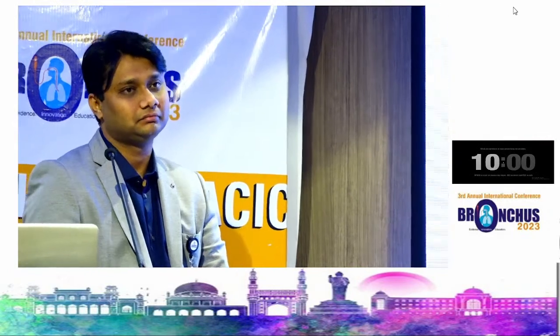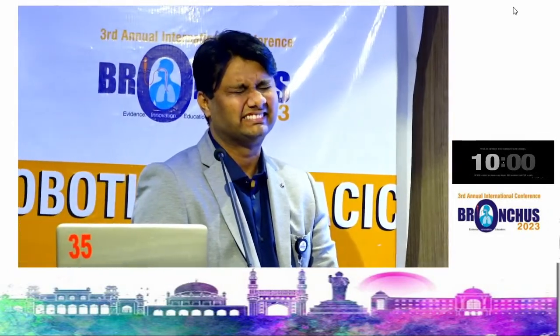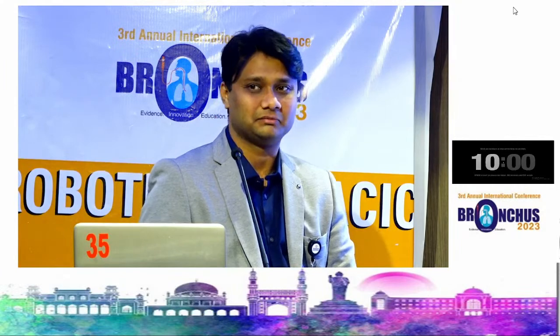Yeah, recently with black I had a problem. I had put a blue for the bronchus, but it was persistently showing thick tissue. Yeah, it actually shows that it's thick, but then I forcibly made the robot fire and it cut it. One of the ways to do it is, if you have very thick tissue, you can clamp it twice or thrice. Clamp it and then clamp it again and reduce it.